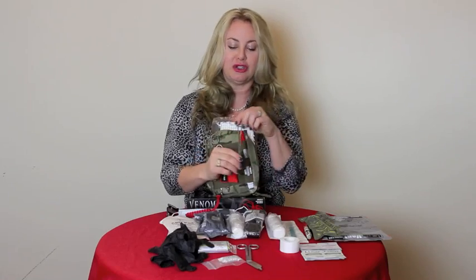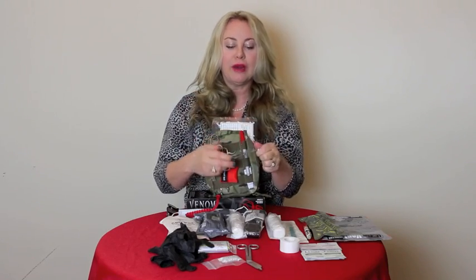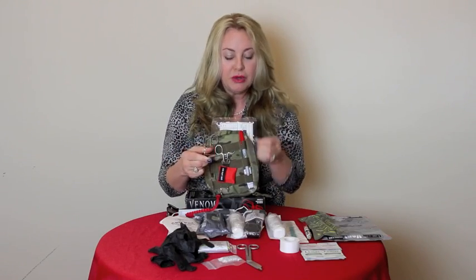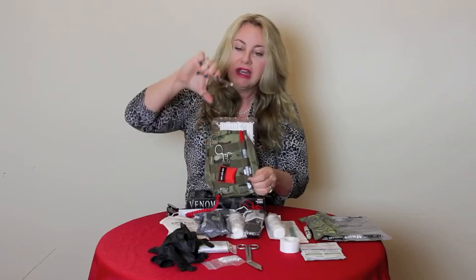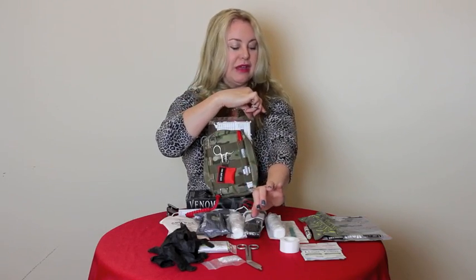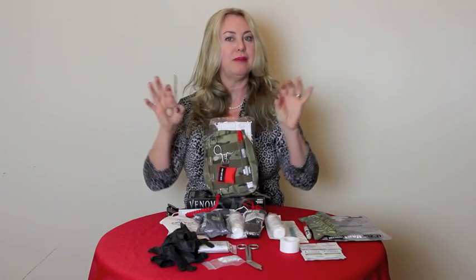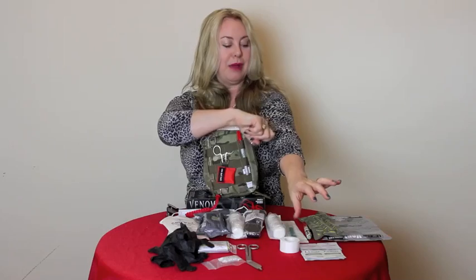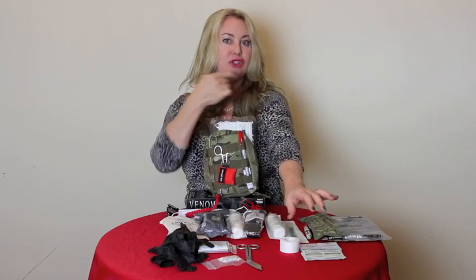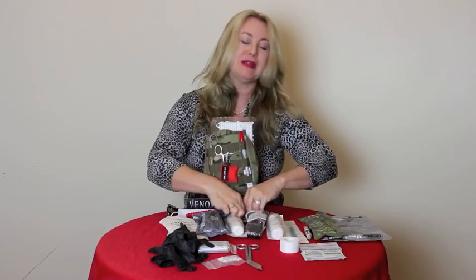The other outside instrument that you see is actually a curved hemostat. Now, curved hemostats are great if you can observe where the patient is bleeding from. You can see the artery or the vessel. You can open these up and actually clamp that off. Generally speaking, they're going to be on the side of the wound that's closest to the heart, because remember, the heart is pumping the blood away and possibly out of the wound. So you're going to be looking in that area closest to the heart for those vessels. So if you can get a hold of that vessel, it's going to stop the bleeding.